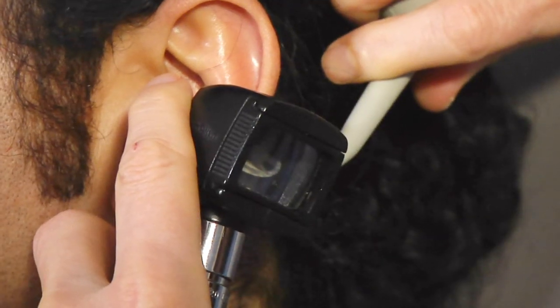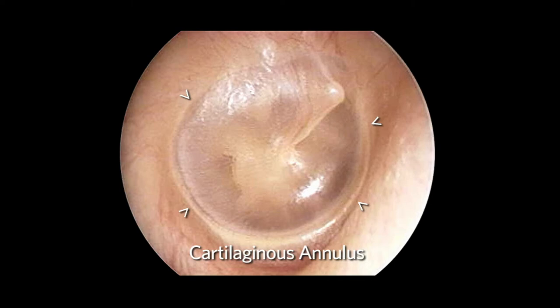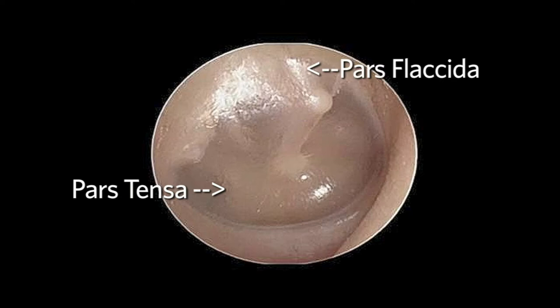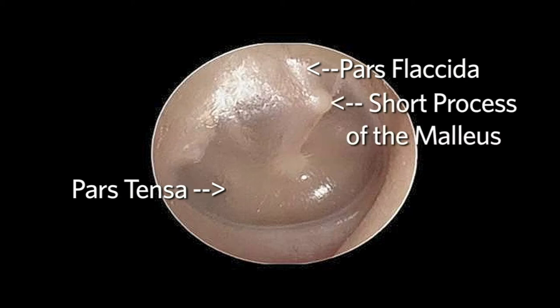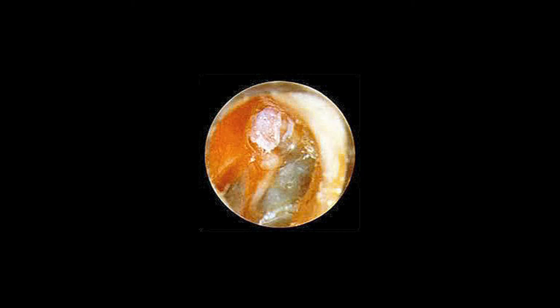This needs to be done and documented on every pediatric patient and be accomplished on every adult whenever possible. In the pediatric patient, the tympanic membrane may appear to be normal but have no mobility, suggesting the presence of an effusion in the middle ear. Surrounding the edge of the tympanic membrane, one often sees a white structure, which is the cartilaginous annulus. The tympanic membrane itself is made up of two components: the pars tensa, which makes up about 90% of the tympanic membrane, and the pars flaccida. The pars flaccida sits above a bony prominence known as the short process of the malleus. The pars flaccida may be retracted and be the presenting site of a cholesteatoma.